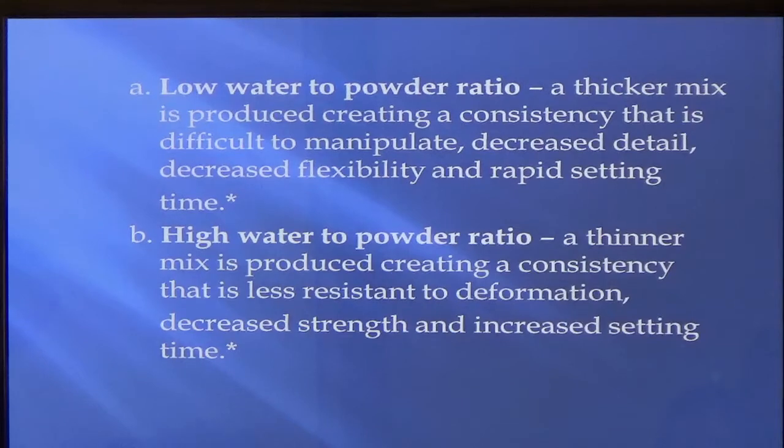You're going to put it on your tray and it's going to start drooping to the side. And other than taking longer to set and tearing real easy and deforming, especially if you're doing the upper, you have the chance of the patient gagging easier because it's going to want to run down the back of their throat.